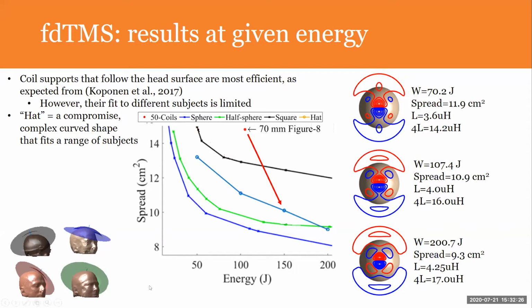We also use the fact that we didn't use a planar surface here, but the triangles were spanned on a surface that is as tightly fitting as you can have for it to fit multiple separate subjects. So a representative set of all the human heads.